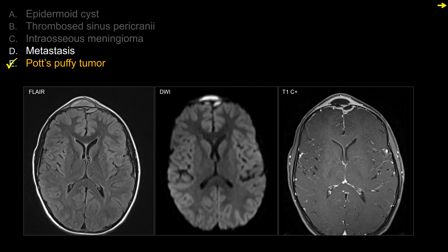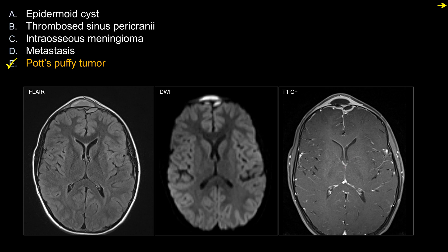Ruling out choice D for metastasis: a cystic metastasis is possible, but not seeing any soft tissue component or enhancing soft tissue component makes metastasis very unlikely in this case. So in the end, the best choice is E, Pott's puffy tumor.